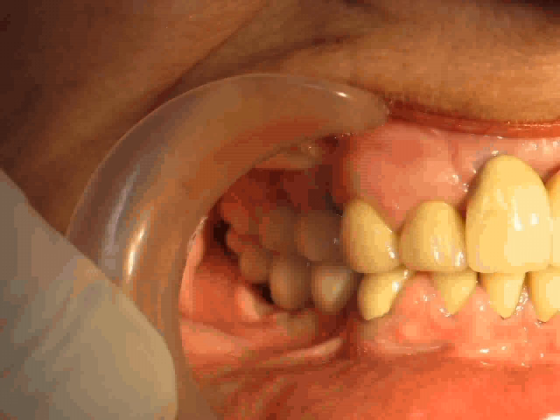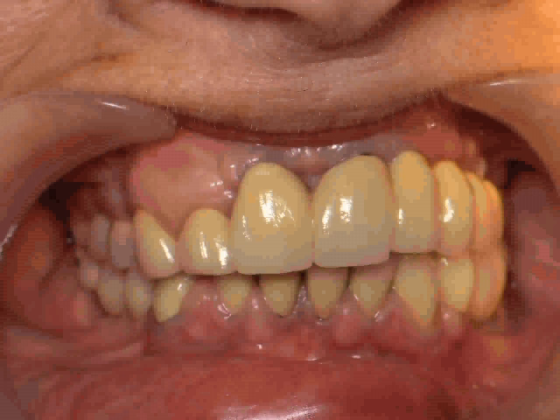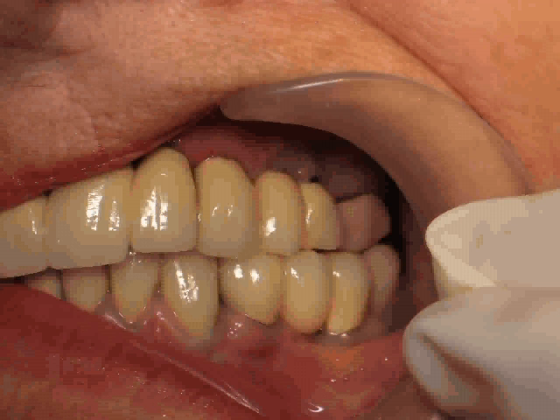This is the right side where we placed the custom Endosteal implant. After the tissue was healed and we placed the crown and bridge, it was at a relatively normal level. On the upper anterior and left side, we placed several implants after we had split the ridge. The final result was that we didn't get the bone regeneration around the ridge augmentation as we did around the custom Endosteal side.